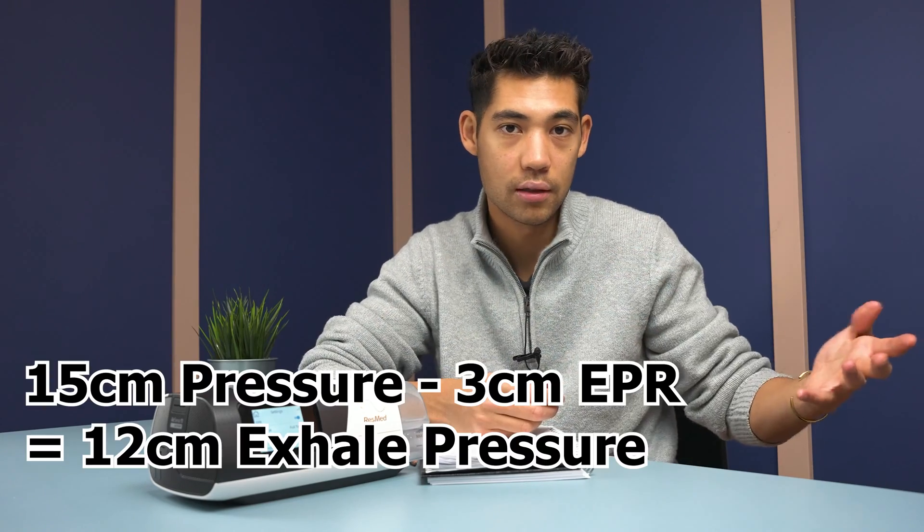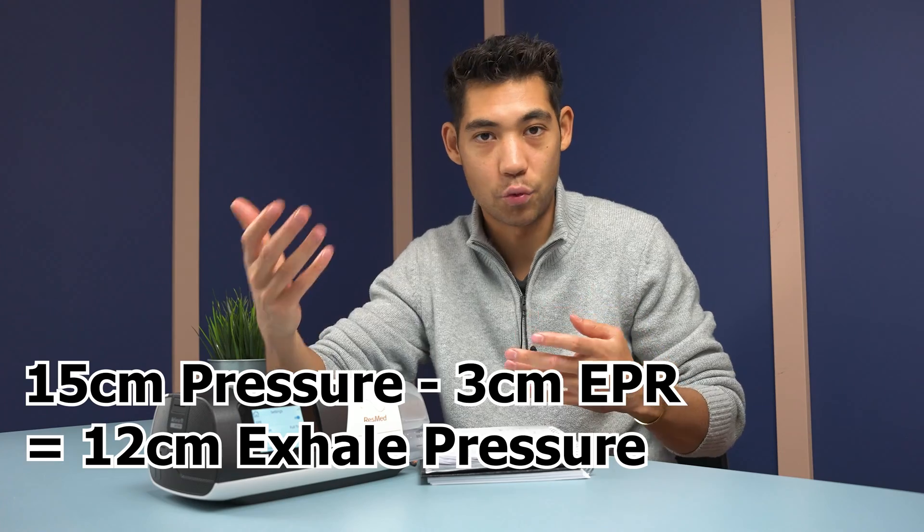If you're at a pressure of 15 and you set EPR at three, 15 minus three is 12. So when you exhale, it's going to be giving you 12 centimeters of water pressure.